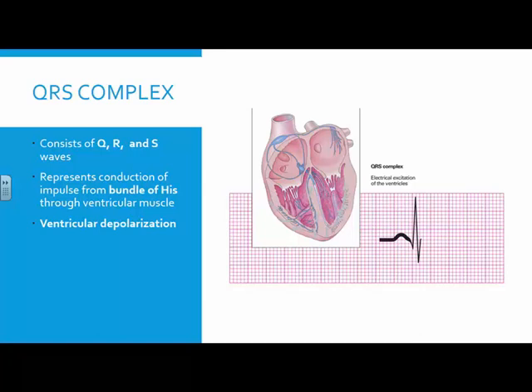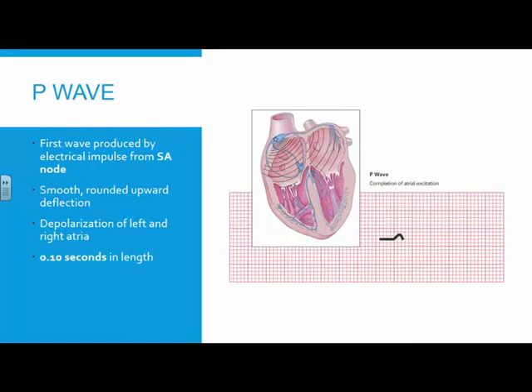Meaning that that's where your negative and your positive waveforms are coming, because when we're looking at it in a lead 2, and I promise we'll get to lead 2 in just a little bit, you've got a series of times in which the electrical conduction goes towards and away from that lead in order to cause the ventricular contraction. Okay? It all builds on each other.